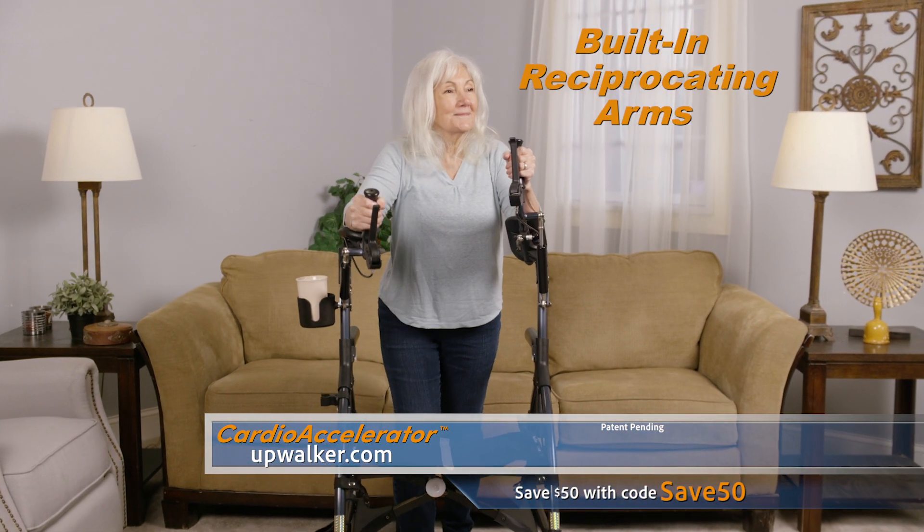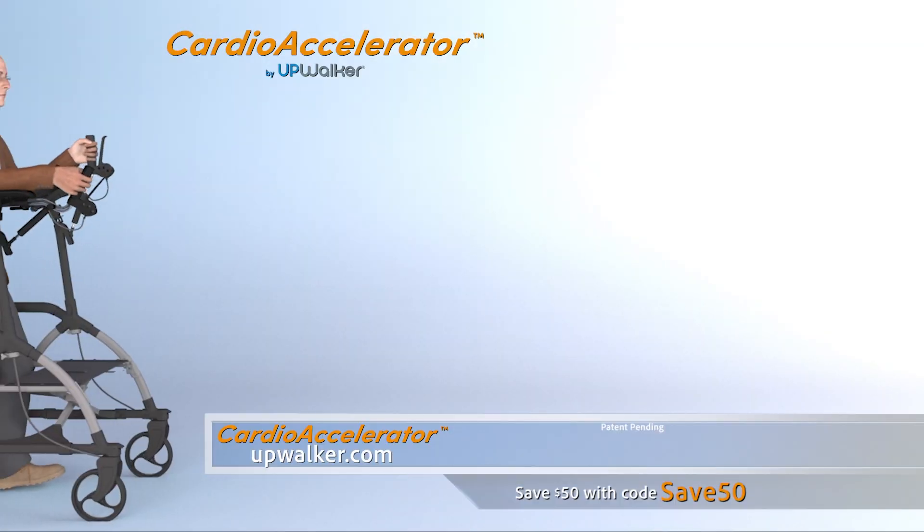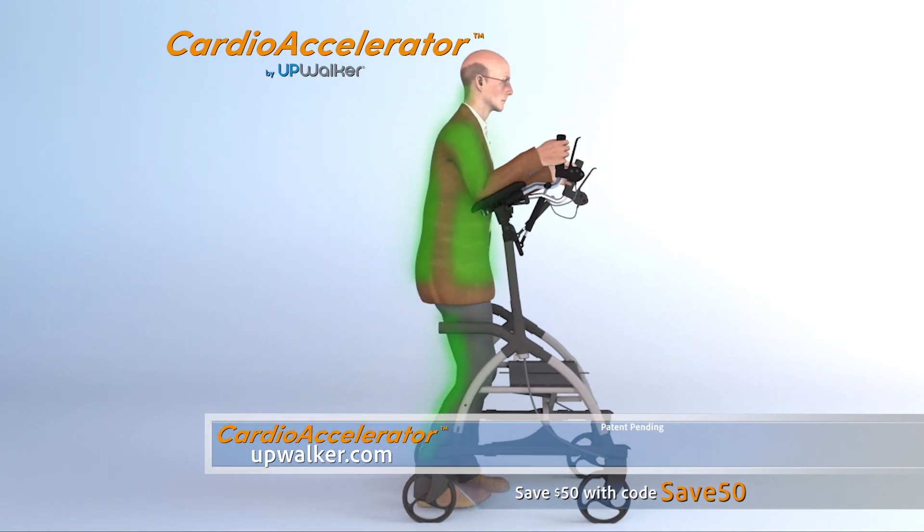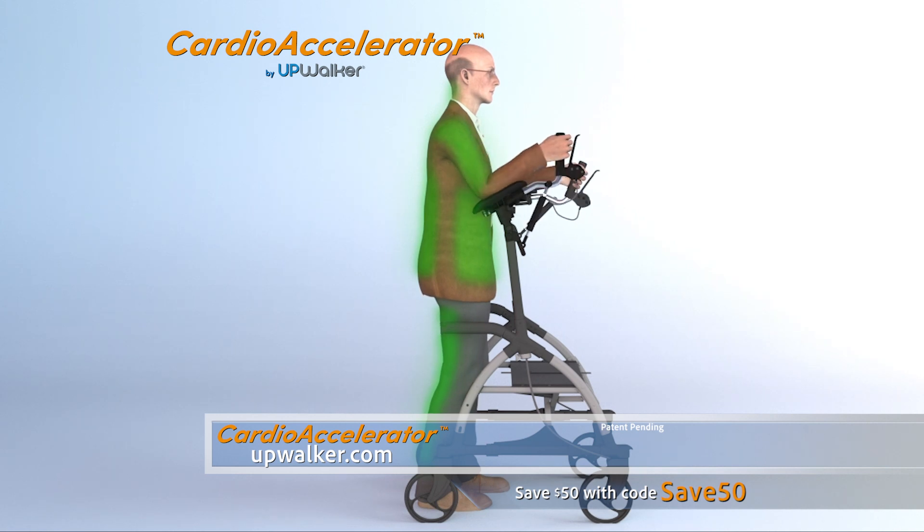But what makes the Cardio Accelerator truly unique are its built-in reciprocating arms. The wide range of motion invigorates muscle groups like the arms, back, legs, and core, reducing fall risk and improving balance while exercising.